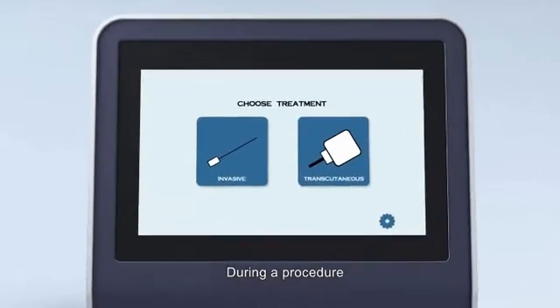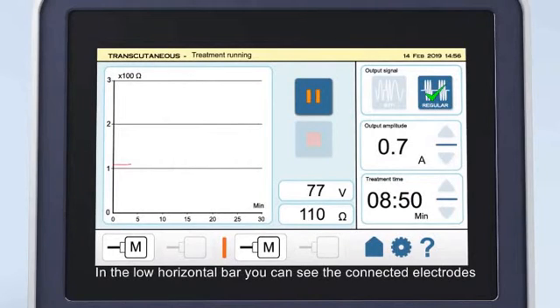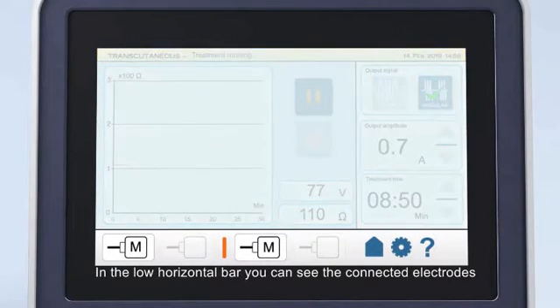During a procedure the screen shows all the information you need such as impedance and remaining treatment time. In the lower horizontal bar you can see the connected electrodes.